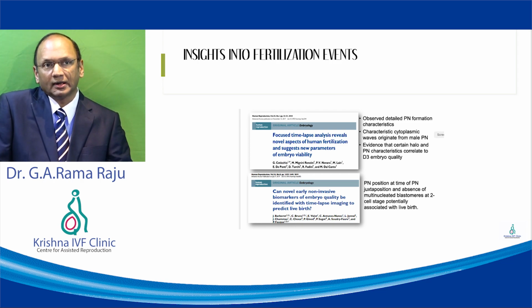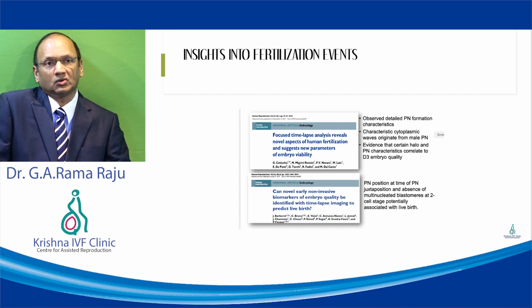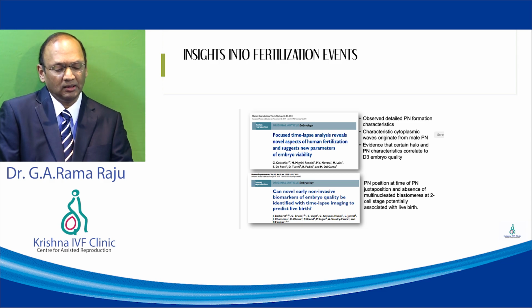So, the evolving technology is moving toward minimizing the number of embryos and also predicting their implantation potential, so that with time we will be able to reduce the number of embryos we are going to transfer and also select the optimal embryos.